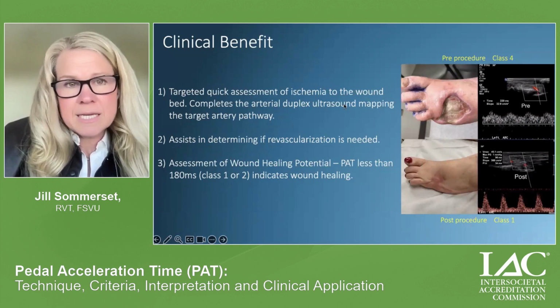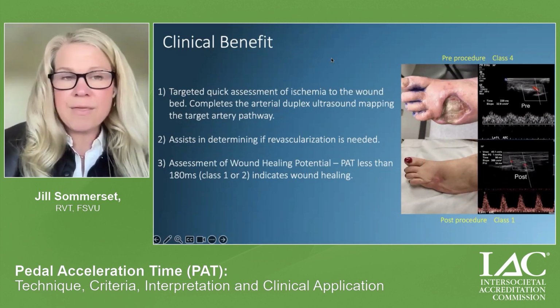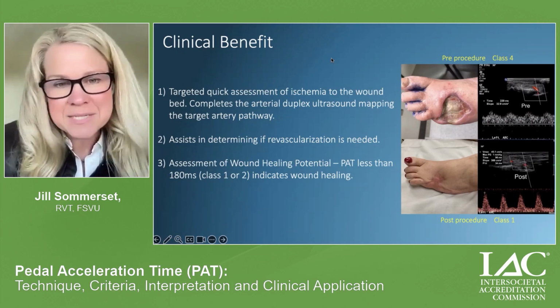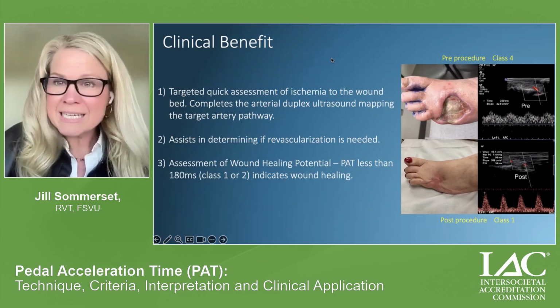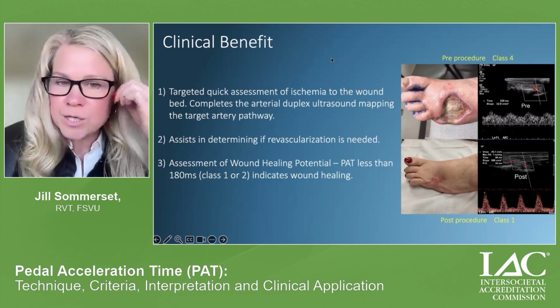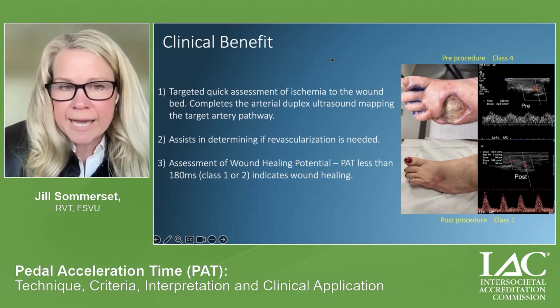And I think the nice thing is there's so much clinical benefit to our multidisciplinary team, whether that's podiatry, wound care, vascular surgery, IR, IC. Vascular ultrasound really plays an integral role in the care of these patients. So this is a nice targeted quick assessment that can really evaluate what the perfusion is like to the wound bed.